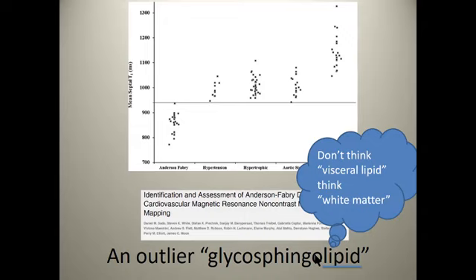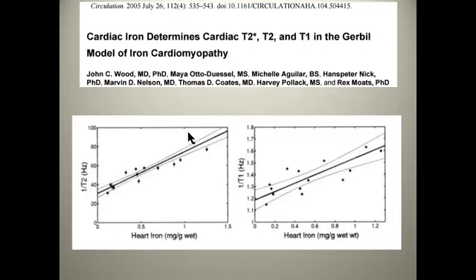So if you do MR spectroscopy on this, you don't see any CH2 groups. It's not lipid at all. It's much more like white matter, which has the same characteristics. It has this shortened T1 because effectively the water's interacting with the glycosphingolipid proteins. So that's one to look out for and explain to them politely.